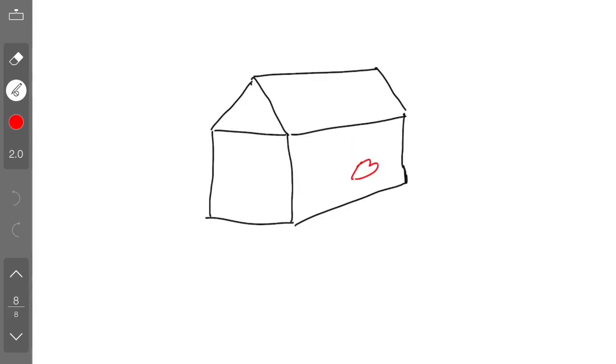Now this is the house, but I'm representing the trunk of the patient, and we learned that inferiorly, 2, 3 and AVF were like windows over here. This 2, 3, AVF will be at the center, 2 and 3 on either side, and we had AVL over here and D1 over here.